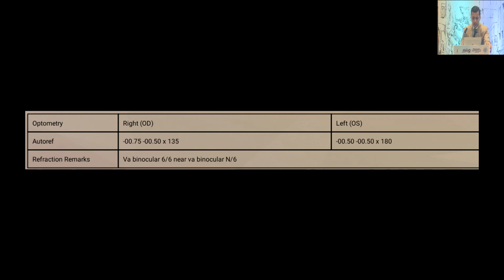This patient is now settled down with minus 0.75 and a minus 0.5, which is a fairly good outcome, and I hope this patient doesn't decompensate, because post-atropinized also the patient was at a 5.5. But it goes to show you that these lasers can not only treat myopia and astigmatism excellently, but these topo-guided treatments can also treat hyperopias quite nicely. The only difference I make in hyperopic LASIK, as I was told by one of the senior engineers, Ankur, is don't do it on the patient's visual axis, but try to do it on the center of the cornea, and I do value that point.